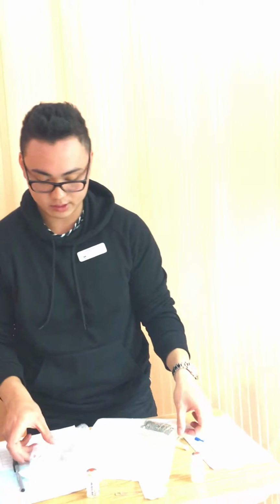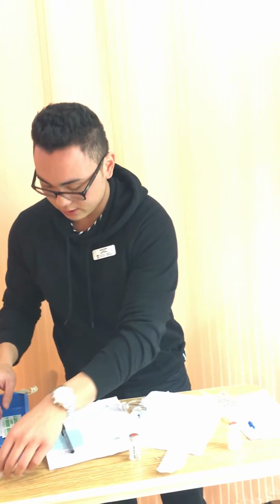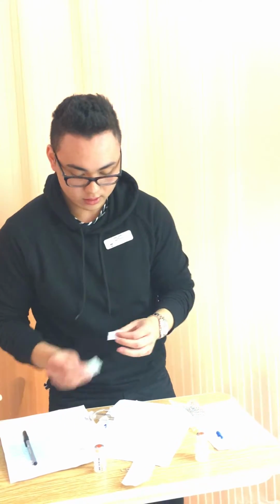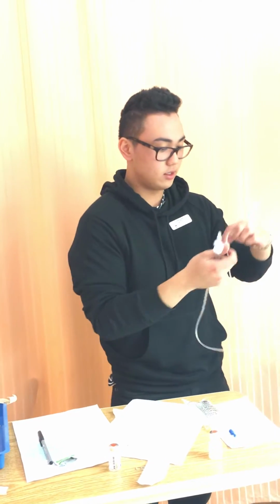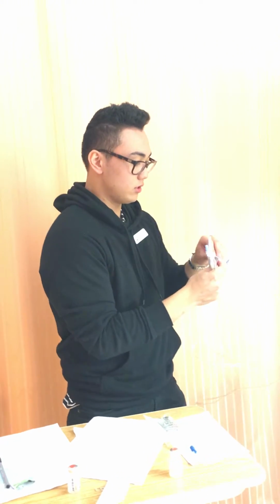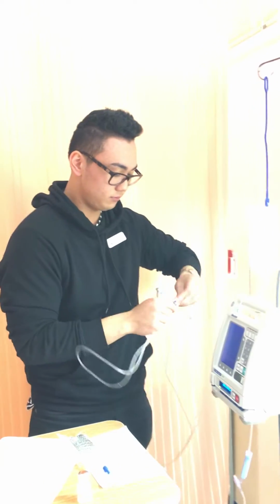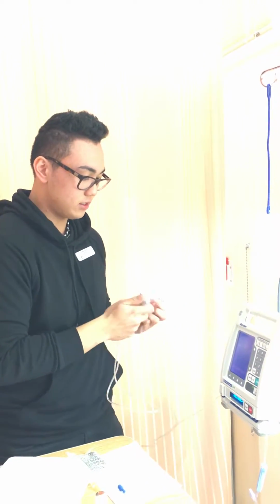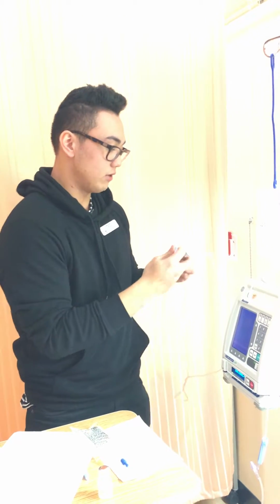those problems for you. And with my tubing, I'm going to have a label, the time, the date, and the name. And I'm going to get my MAR. So while we connect our tubing, you gotta make sure, check the tubing for its integrity, and there's no clear breakage of sterility. Okay. So we'd have to swab this port right here for 30 seconds. 30 seconds has passed. Okay, now without ruining the sterility, we will connect the port to the IV line.